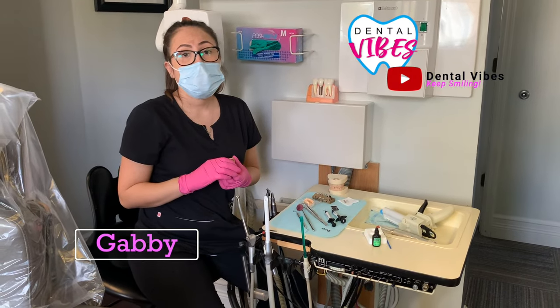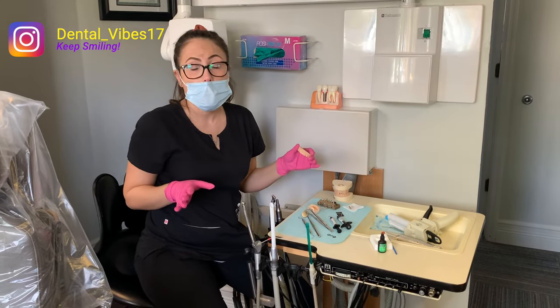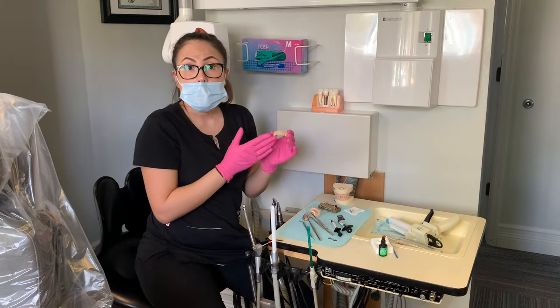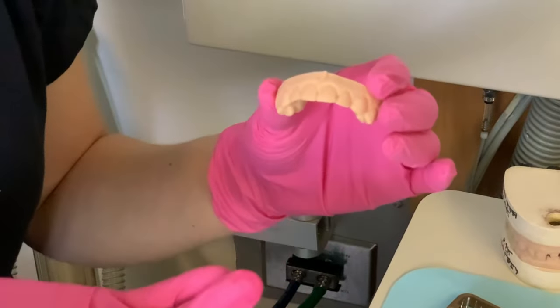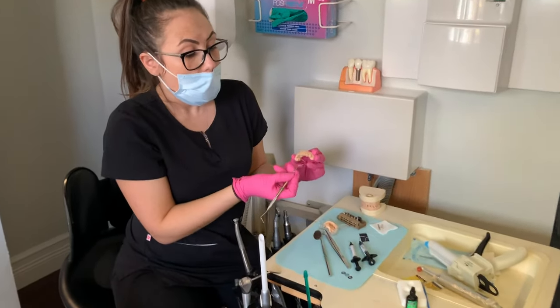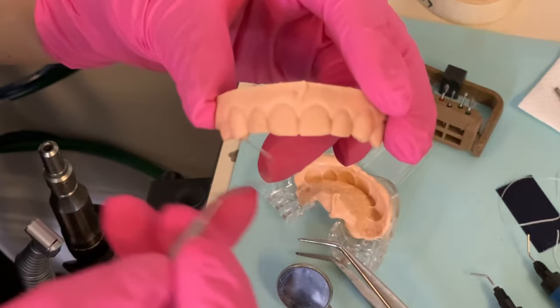The first thing you need to do for your temporary is take an impression of the teeth. For an anterior temporary, you want to make sure it is as perfect, natural, and beautiful as possible — obviously for your patient to walk out with a happy face and a beautiful smile. I have the model here showing what the patient looked like before. We were replacing a crown so her teeth did not look broken or too bad. It's not going to be the case with every patient. If you have a patient that came in with a chipped tooth broken in half, or sometimes patients have abfractions on the neck of the teeth — any irregularity like that — you want to make sure you correct it before you take your impression.